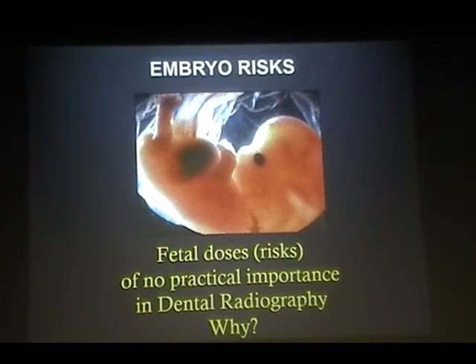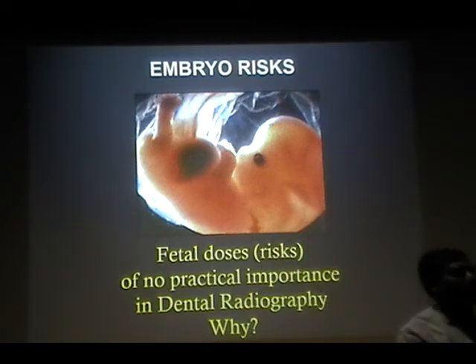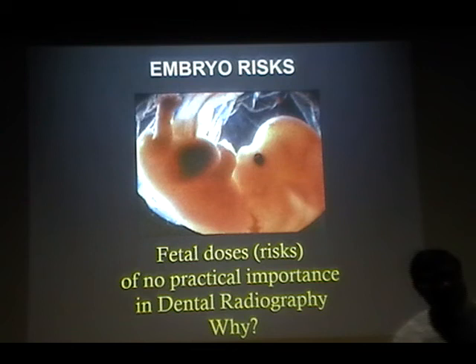No, we are just talking about dental, so forget about all other things. Let's focus, because we got the information from there, now we are drilling down to dental. It also depends on when the last radiographs were taken. If they're a new patient and you're establishing a new patient, then obviously you want x-rays more than if it's a 6-month recall.